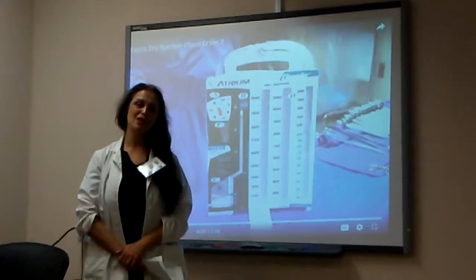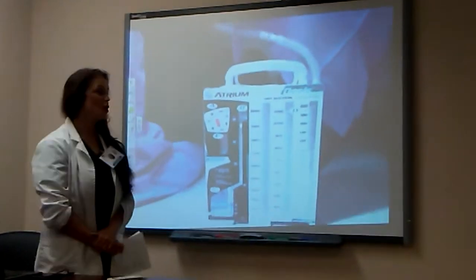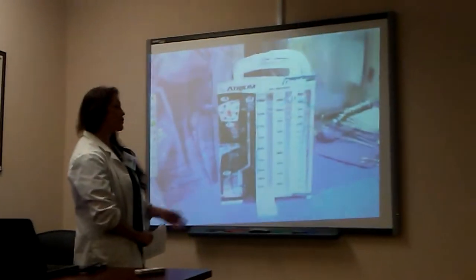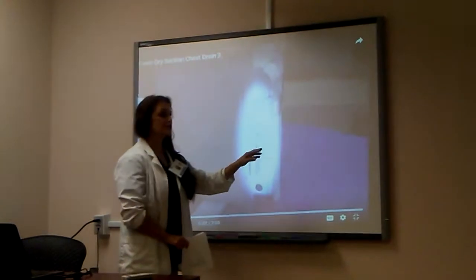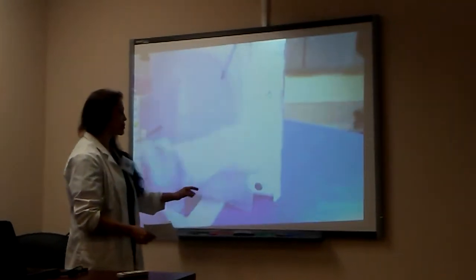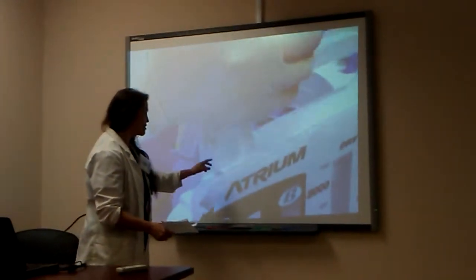I want to take a few minutes of your time to talk about another critical care presentation, and that's chest tube. We previously talked about collapsed lung. Well, one of the remedies for collapsed lung is the insertion of a chest tube. It's called a closed drainage system. There are 3 chambers in the chest tube. There's the water seal, the wet suction, and the dry suction. You as a nurse will actually put the water in for the water seal.